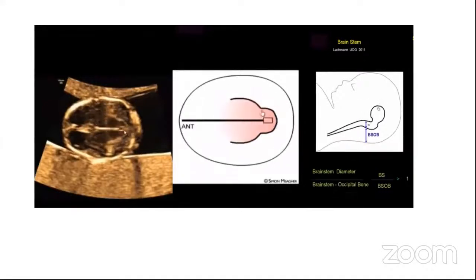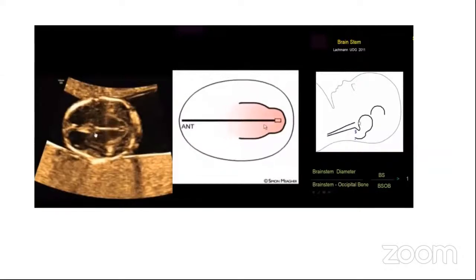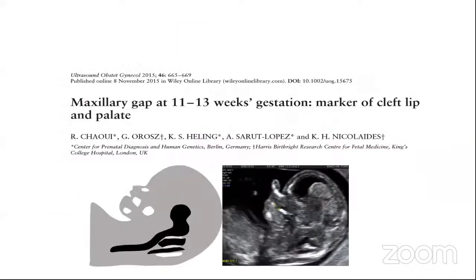So these are obviously not diagnostic signs. We just have to go and look at the fetal spine in detail. TVS is the best way to look at any fetal anatomical structure to get a very good delineation, and almost always we can diagnose these abnormalities.